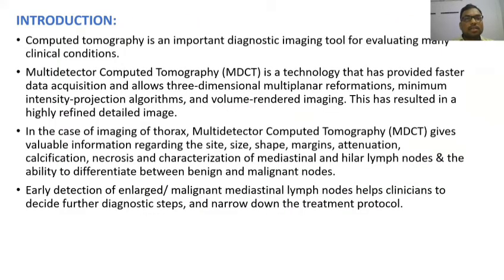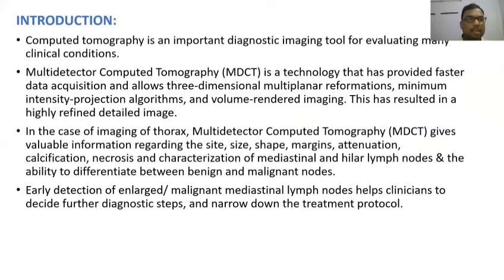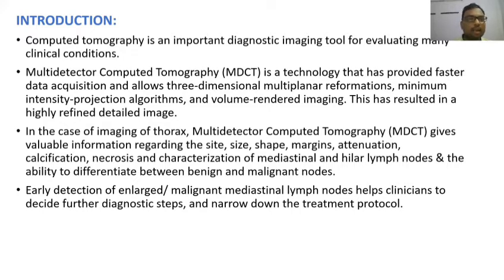Introduction. CT is an important diagnostic tool for evaluating many clinical conditions. MDCT is a technology that has provided faster data acquisition and allows three-dimensional multi-planar reformations, minimum intensity projections, projection algorithms, and volume-rendered imaging. This has resulted in highly refined detailed imaging.